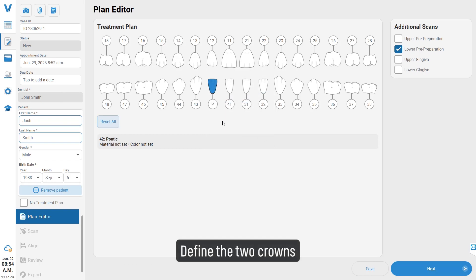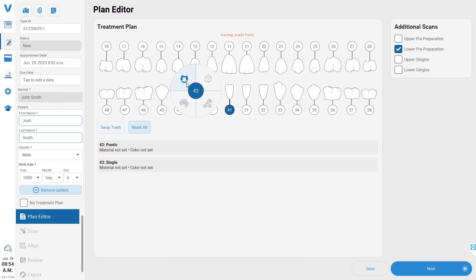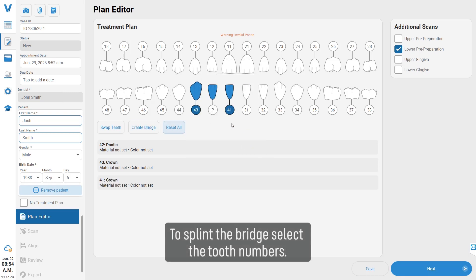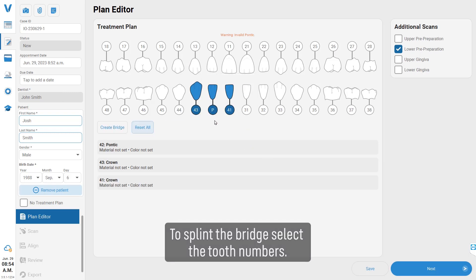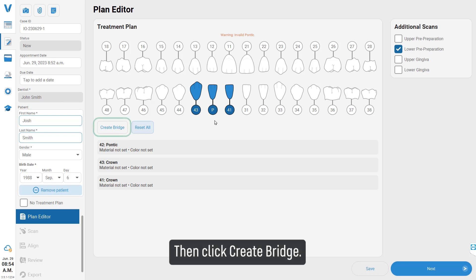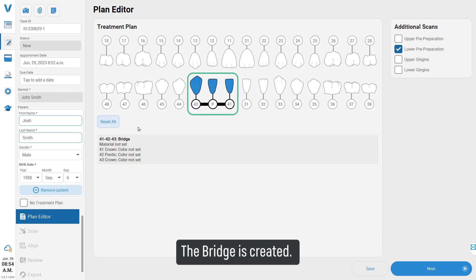Define the two crowns to splint the bridge. Select the tooth numbers, then click 'Create Bridge.' The bridge is created.